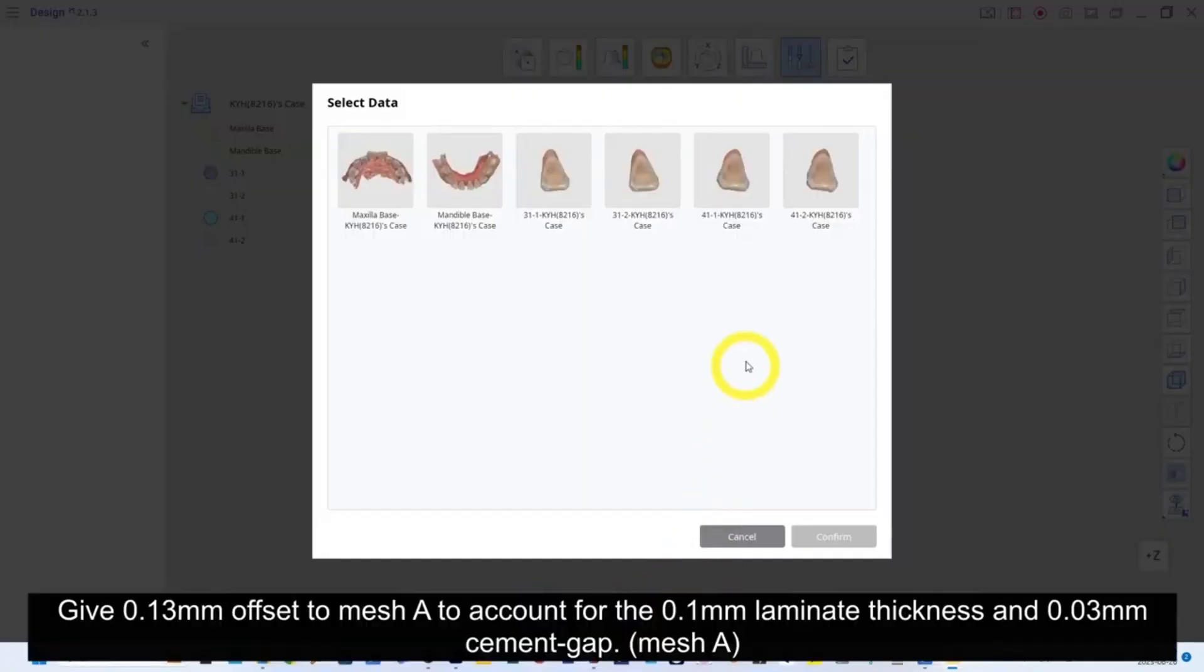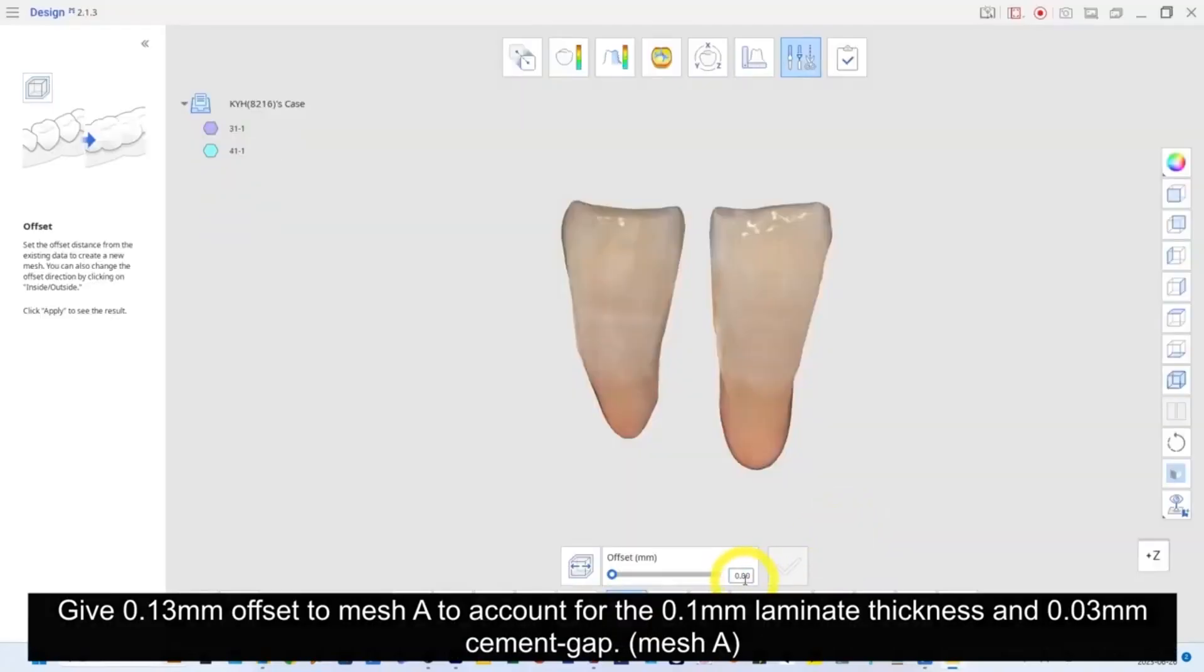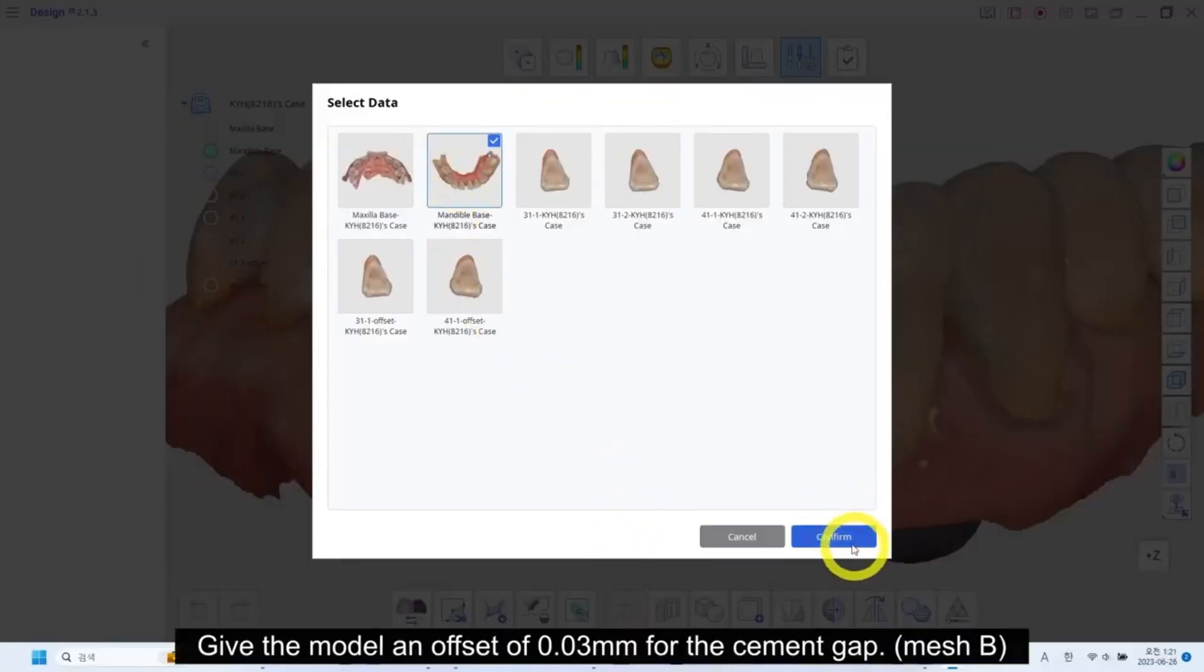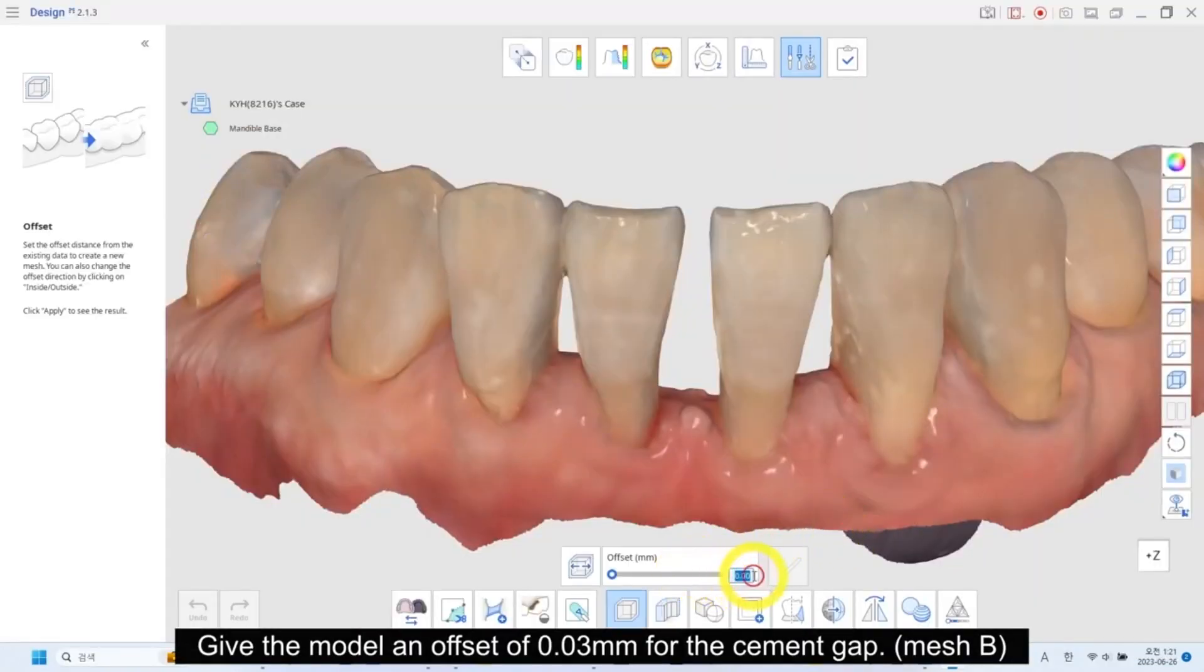Give 0.13mm offset to mesh A to account for the 0.1mm laminate thickness and 0.03mm cement gap. Give the model an offset of 0.03mm for the cement gap.